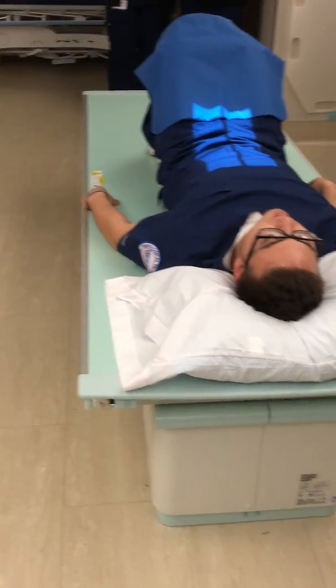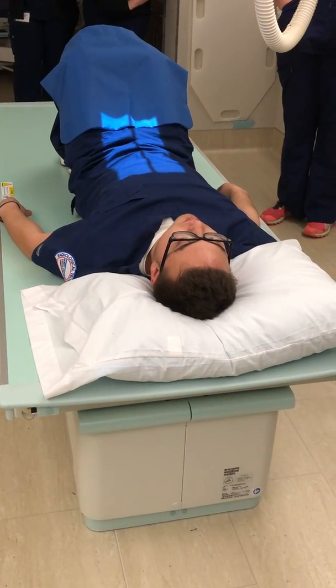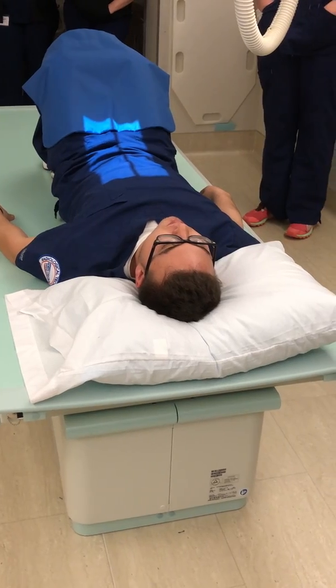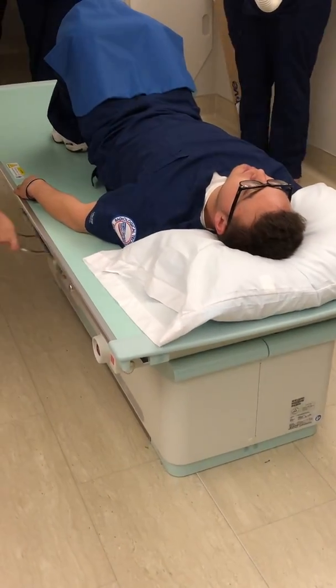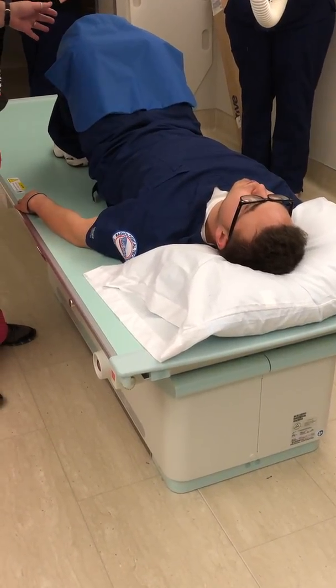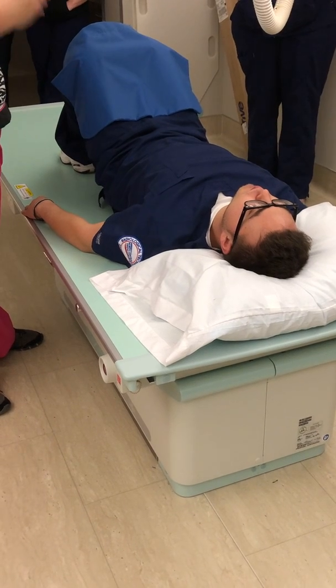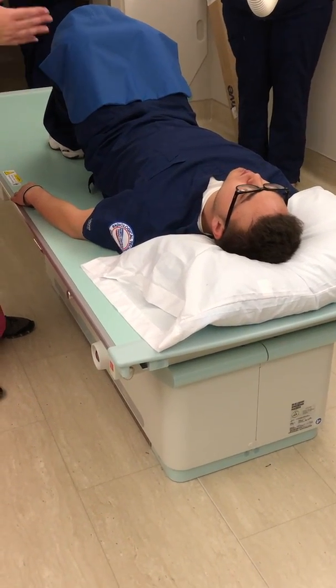I'm going to have you blow all of your air out and hold it out. Breathe and relax. Okay, I get a new IR. Now, we're going to do the RPO next. We didn't go over the order of exams before. From the AP, we moved to the RPO.